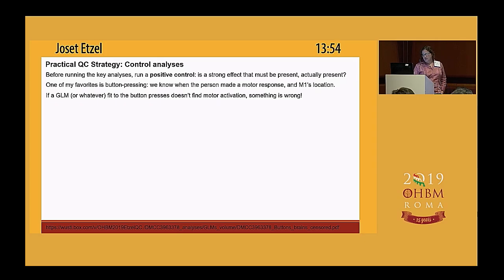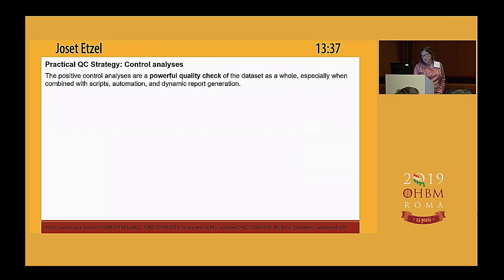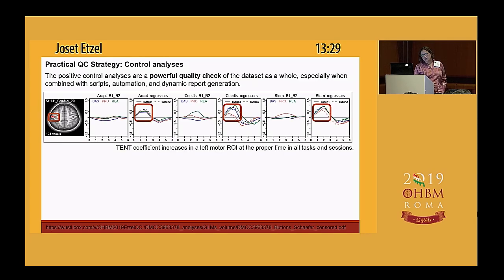You can usually find visual something to use as one of these. That's what I was just saying. So, this is just a picture of one of these from one of our standard files of a single subject. And the colors are kind of lousy, but you can see that, yeah, that does look like motor in this single subject GLM. So here's kind of the thing: using these controls can be, I was saying, a really positive test. So this is another view of one of them.